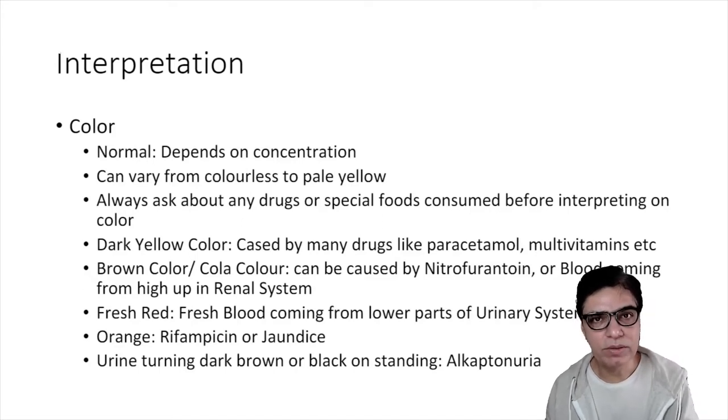So normally you would give them a sterile pot, and you will ask the parents to hold that sterile pot between their legs and massage their bellies or give them some fluids or give them some milk, and they wait till they are able to catch a clean sample.